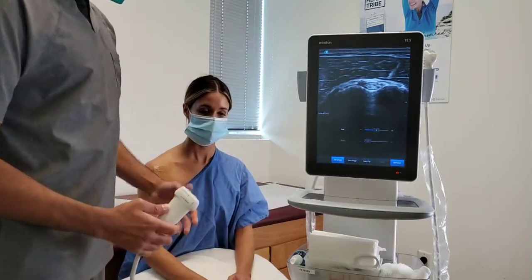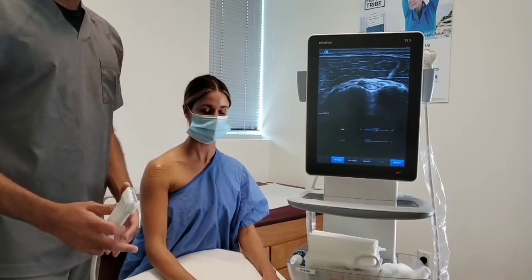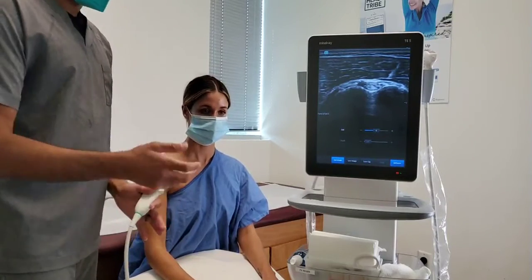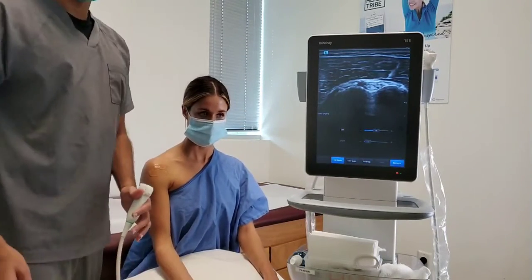So we're going to get started. I'm just going to go through what the typical shoulder ultrasound examination looks like, and I'm going to go step by step, and hopefully you guys can visualize what I'm seeing on the ultrasound.